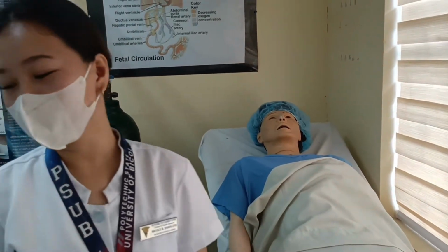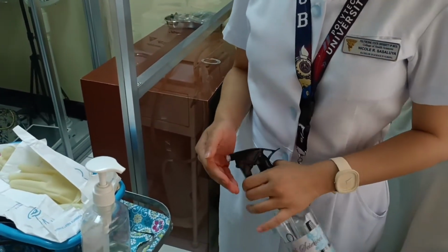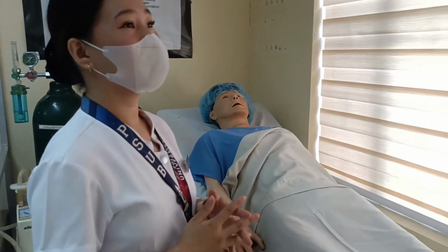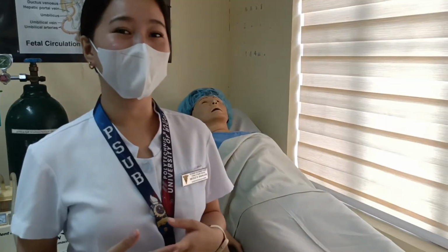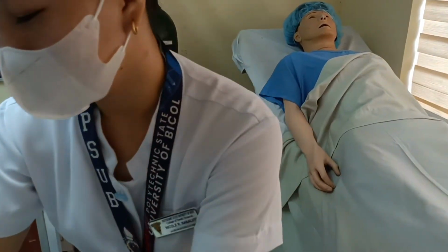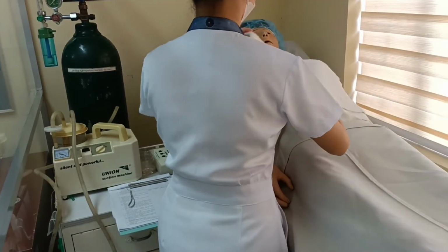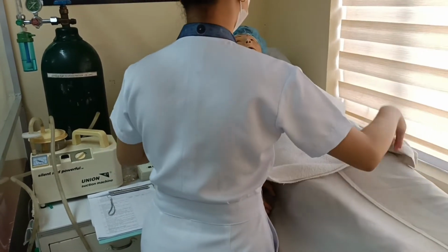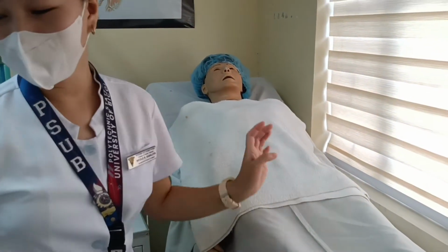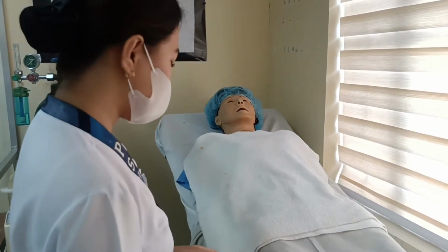Then next, we are going to perform hand hygiene. Then, let's assume that I already closed the door and the curtain for the client's comfort and privacy. Then, we are going to put a towel. Then, we are going to monitor the oxygen saturation of the patient and also the pulse rate using the pulse oximeter.